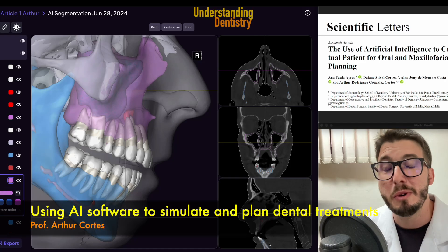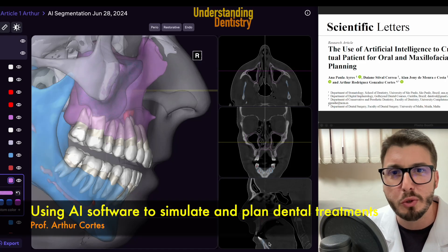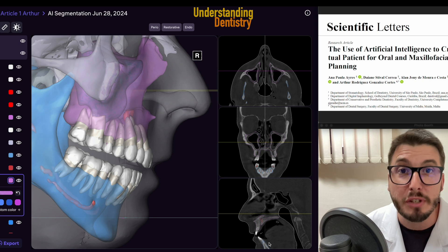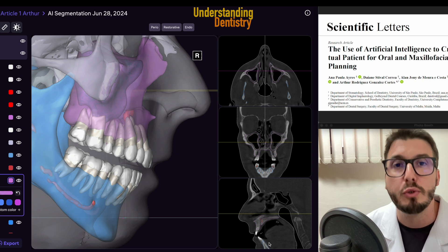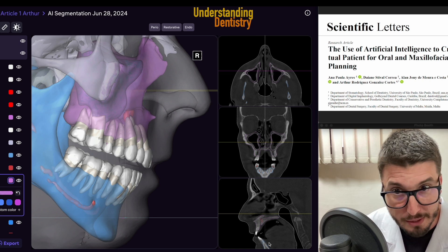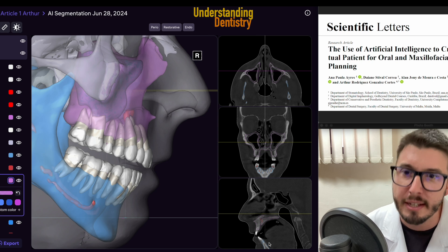Hello guys, welcome to this quick video to show you how to use artificial intelligence software to simulate dental treatments, as easy as it is.